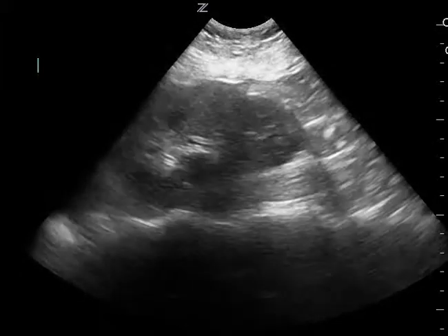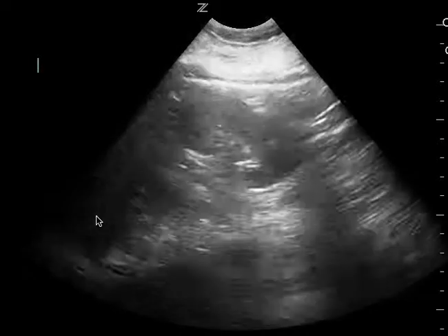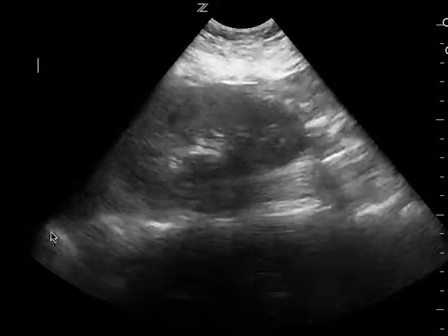This is a fast exam. These are some small details. This is the left upper quadrant. You can see the kidney here. You actually do see the spleen come into view and you do see the diaphragm right there.